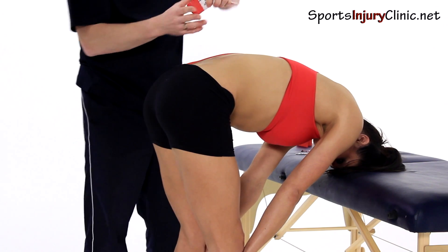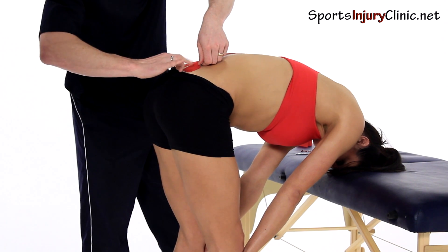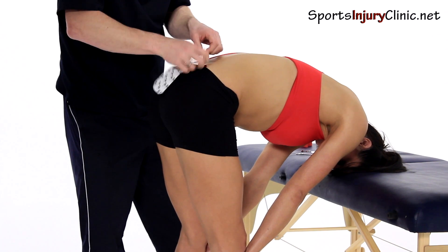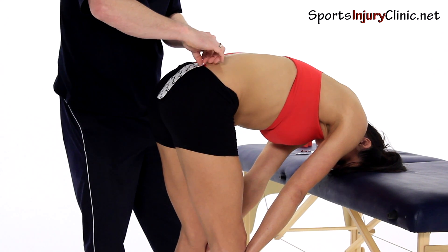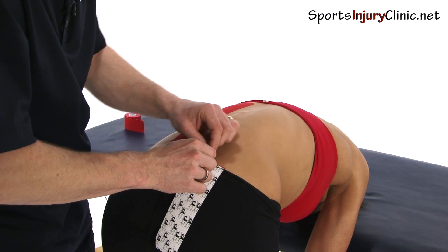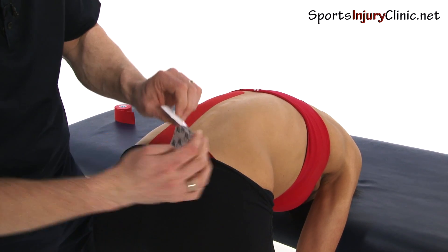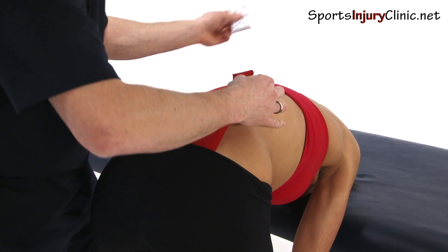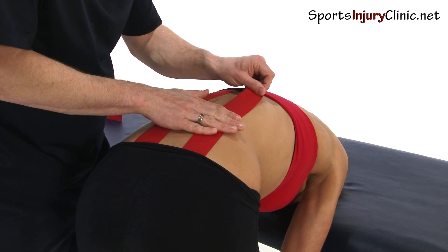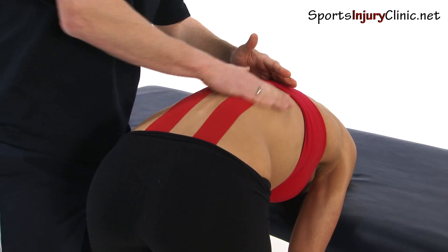The second one, on the other side — again, you're just going to place the base onto the bottom of the muscle with no stretching at all. Then we're going to take the backing paper off again and put a 50% stretch on it, up to there. Again, it's important we activate the glue.